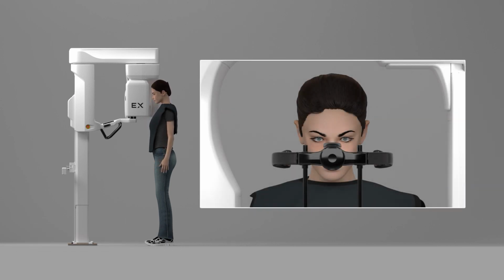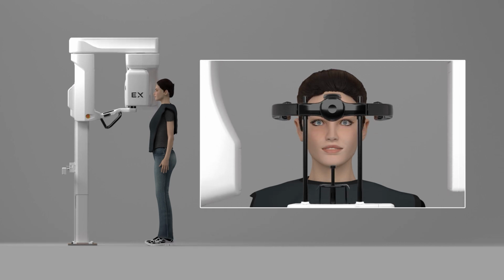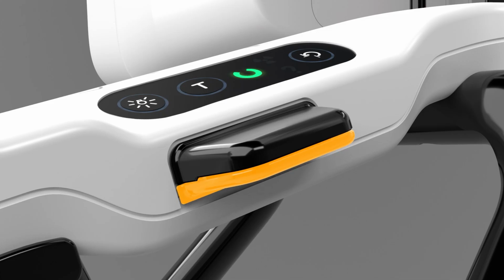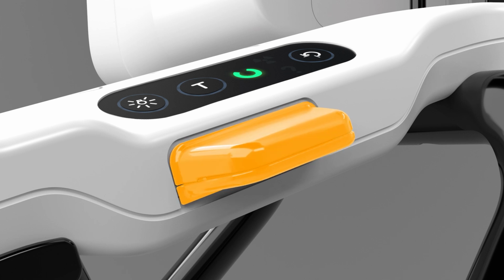With the patient standing outside of the unit, raise or lower as needed so the patient's chin is level with the chin rest. To slowly raise or lower the unit, press up from the underside of the controller or down from the top of the controller. For faster movement, pinch both sides of the controller while pressing up or down.